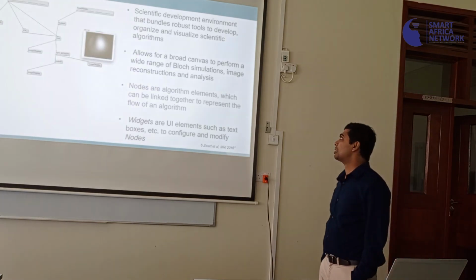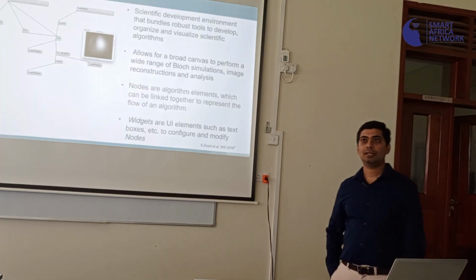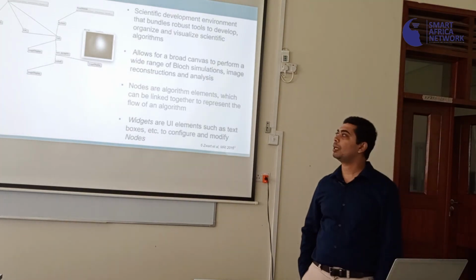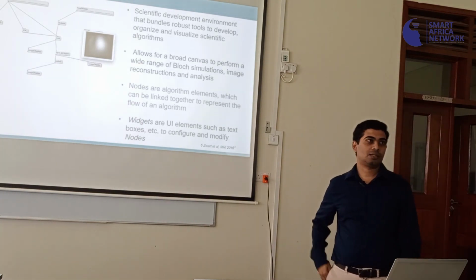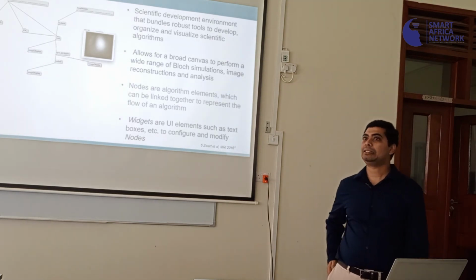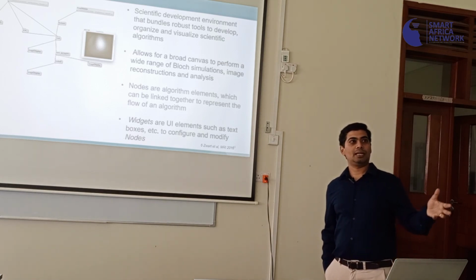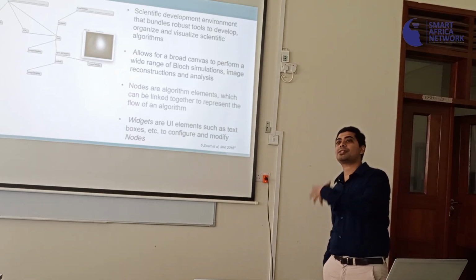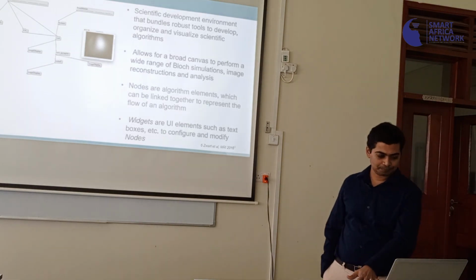So the cool thing with this is you didn't need to know the back-end coding. You could just put a bunch of blocks together and make things work and reconstruct in your language. This is also available for download for free, and if somebody is interested in the general area of, I'm more interested in once the data comes in, can I reconstruct the data? Then this is one of the tools that you can use.